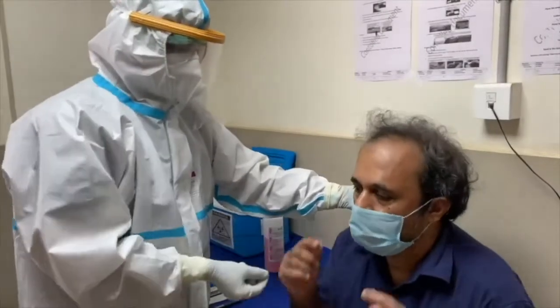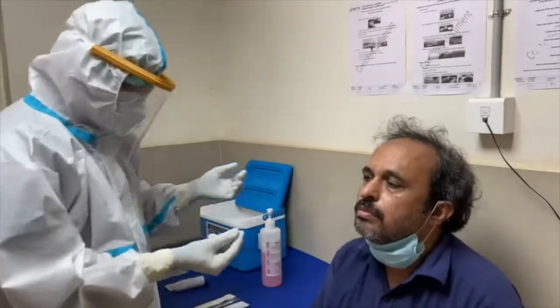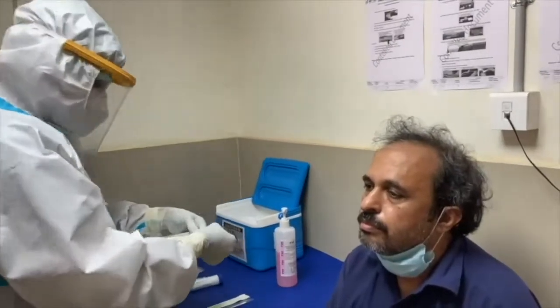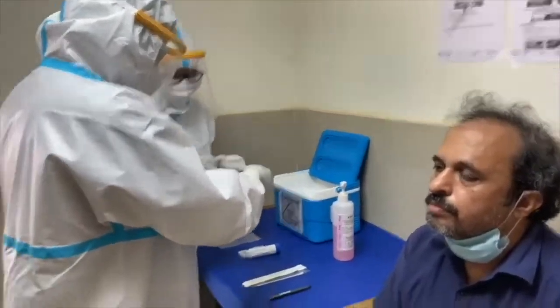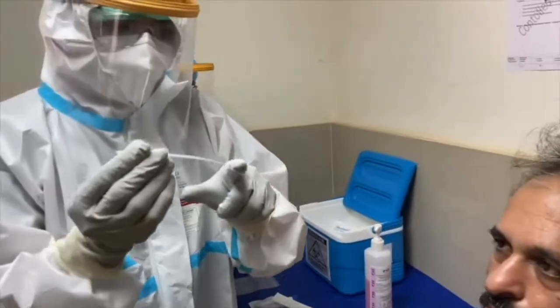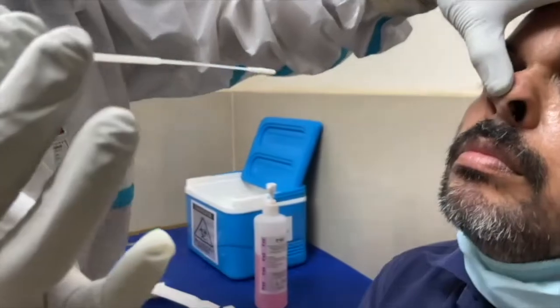In this video we are demonstrating nasopharyngeal swabbing. The patient is seated with the back resting on the wall and the head extended. The nasopharyngeal swab is taken out of the packaging — it is flexible and slender.